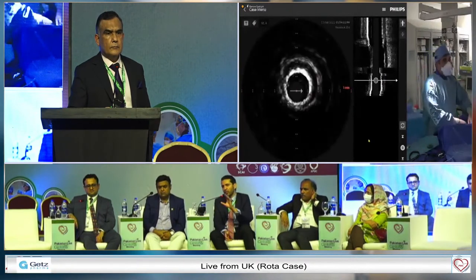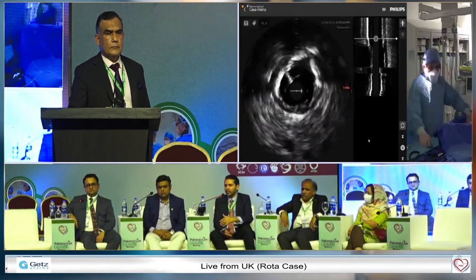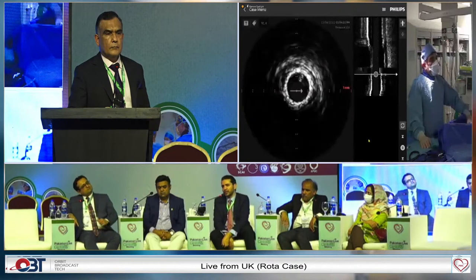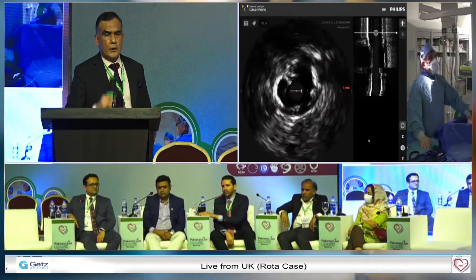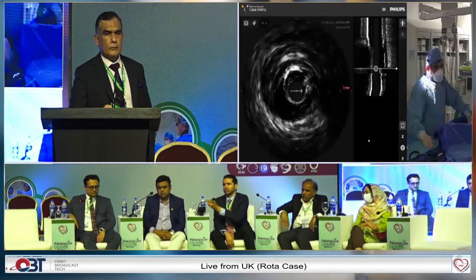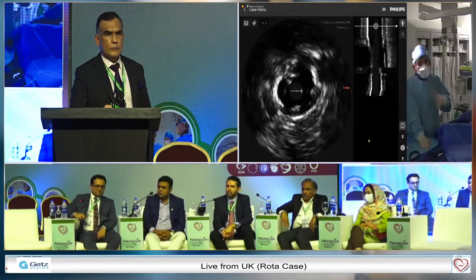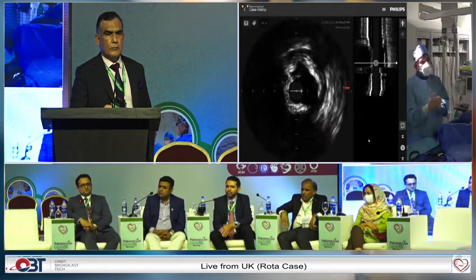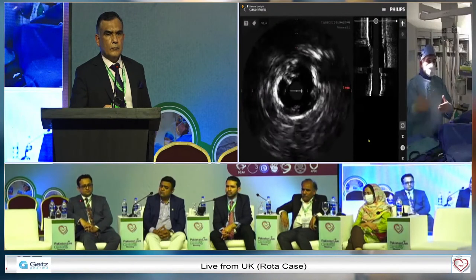After the 1.25 burr, if you do an IVUS, out of caution, which obviously I noticed that there was calcium and a bend, would you have still pushed for going to the higher size burr? Yes. And that's what I did. I took the 1.75 because I didn't think the 1.25 was enough here. This is the message I want the audience, particularly those new to rotablation: putting a 1.25 burr in a big artery, you feel like you've done the rotablation.